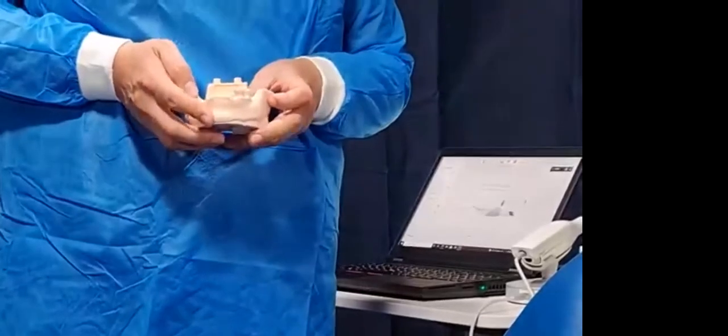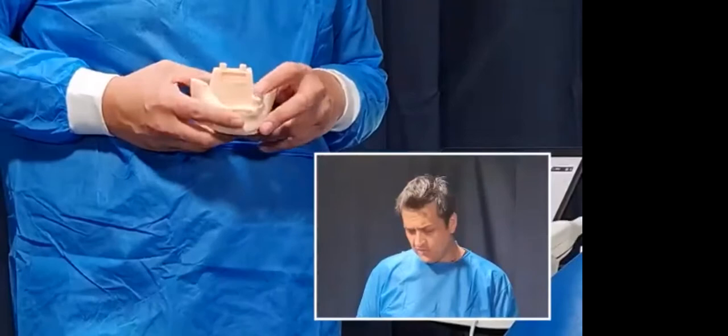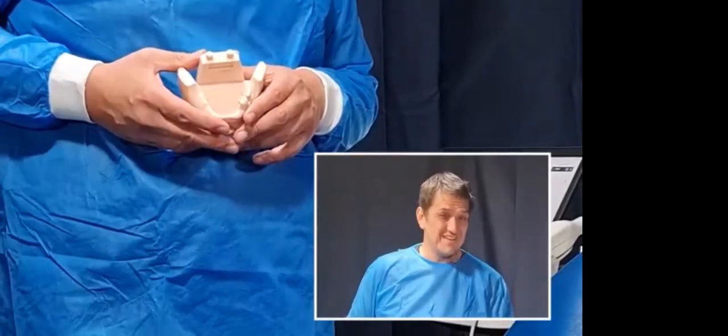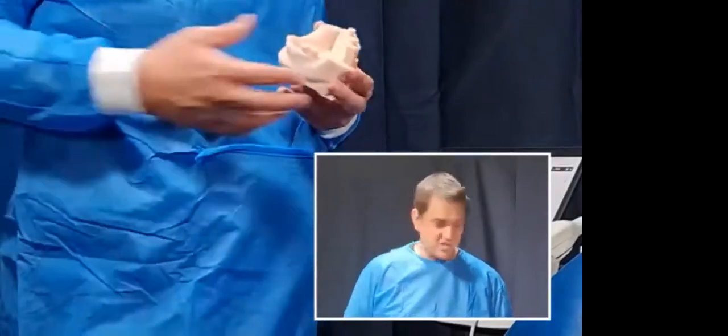These lower standing molars, she had quite good ridges, to be fair. And don't get too caught up if there's a very, very flat ridge, saliva everywhere, and the camera is just not taking photos. It does happen, especially with a long span like this. But in effect, I thought, I'm going to have a good crack at this and see what I can do for this lovely lady. She was actually 97, but she was fantastically healthy. So my scan strategy for this was this.